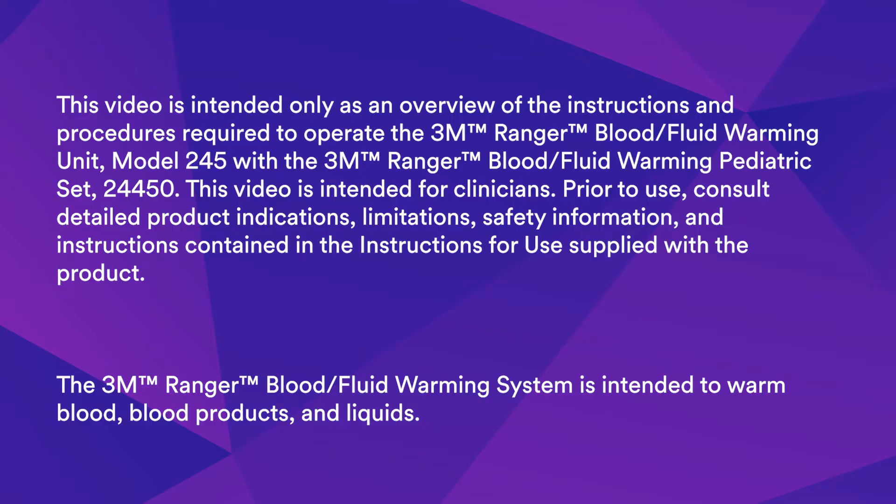This video is intended only as an overview of the instructions and procedures required to operate the 3M Ranger Blood Fluid Warming Unit Model 245 with the 3M Ranger Blood Fluid Warming Pediatric Set 24-450. This video is intended for clinicians. Prior to use, consult detailed product indications, limitations, safety information, and instructions contained in the instructions for use supplied with the product.